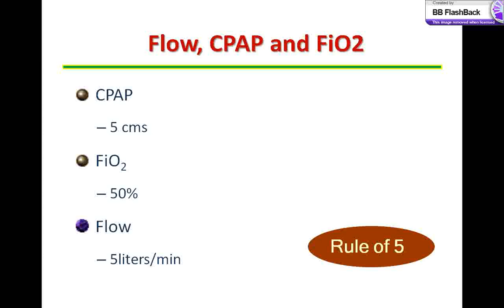For changing the pressure and FiO2, wait for 15 to 20 minutes, and if the retractions are persisting or if the lung volume is low on the X-ray, increase the pressure. If the saturations are low, that is less than 87%, and retractions have come under control, to make sure that oxygen is adequate, increase the FiO2.